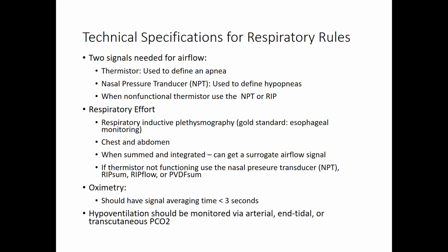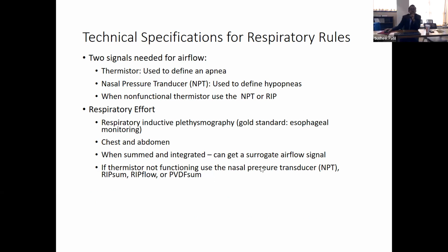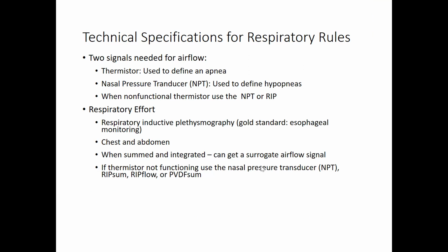Because when this first came out with rib cage abdominal motion, the neurologists included it because they didn't think it was interesting. So it's a two-compartment model. You can measure tidal volume, frequency, and flow rate from measurements of the rib cage and abdomen to about 92% accuracy if you calibrate. And you can calibrate qualitatively by just watching what a breath looks like during wakefulness.